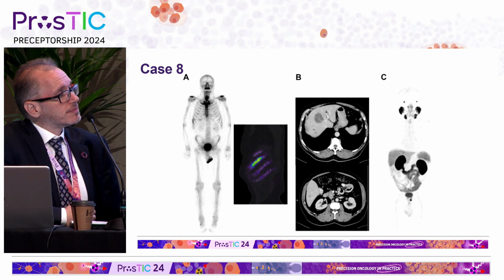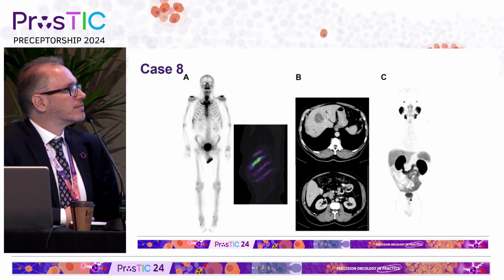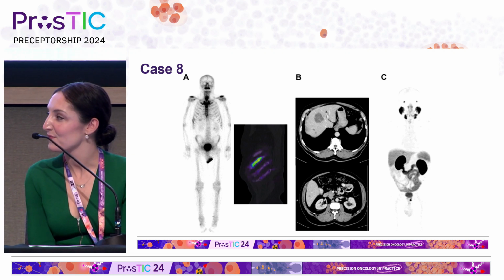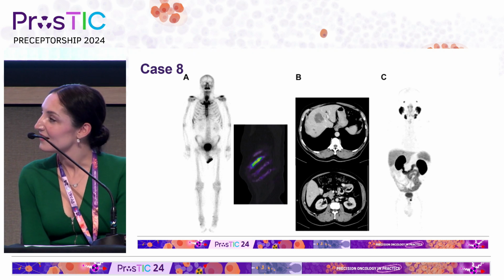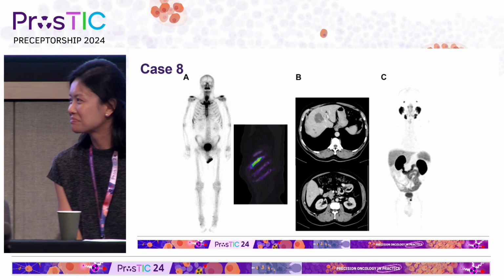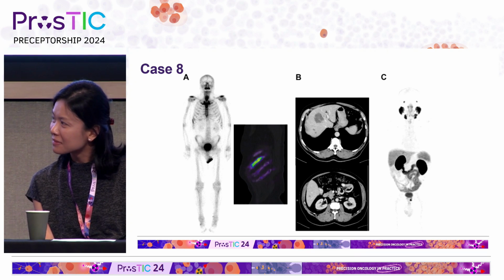Just a quick question. I know this was the pro-PSMA patient, but would you have actually, or any of you, done an FDG PET first before sticking a needle in? Does that make a difference, Louise? I think I would have done a PSMA PET scan first. And it's not PSMA avid. Would we want to do an FDG PET? Yeah, I think no harm doing an FDG PET. Yeah, I think an FDG PET was done in this case, which showed the colorectal primary.